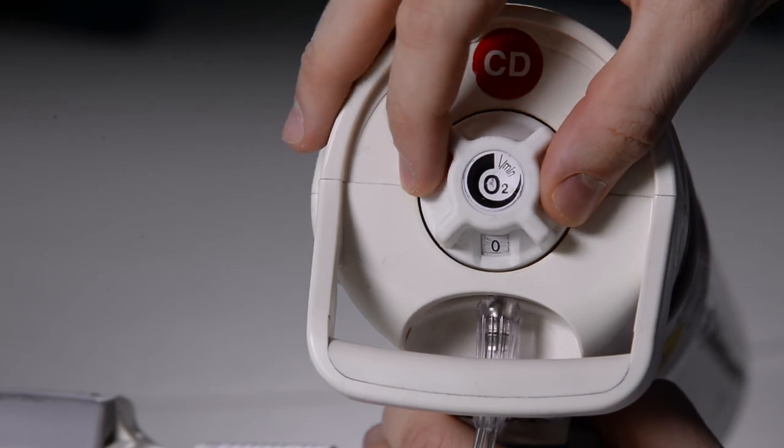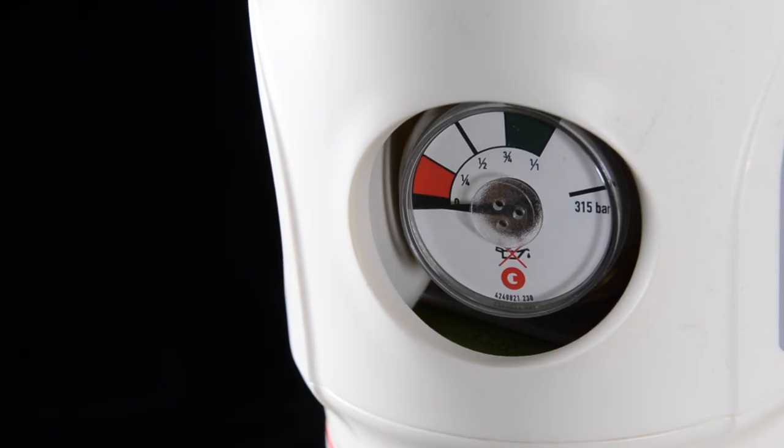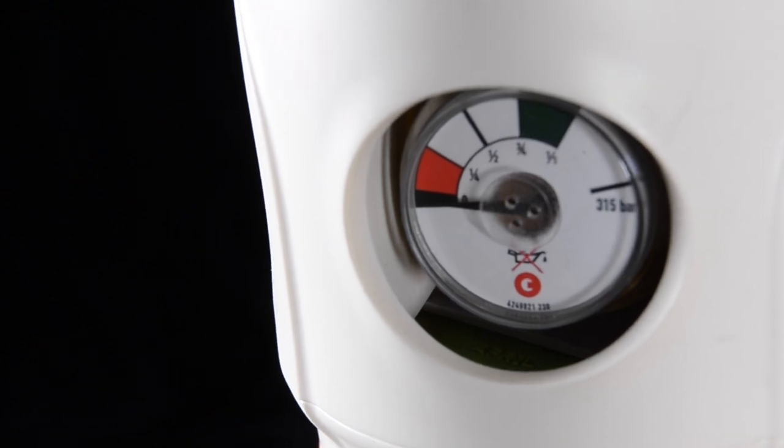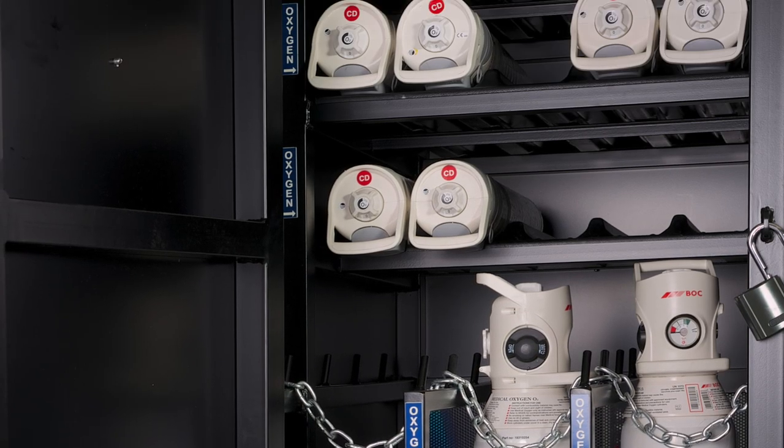Replace the outlet cover by pulling up the hinged grey cover. Check the cylinder gauge for content level and return the cylinder to a designated in-use or empty storage area.